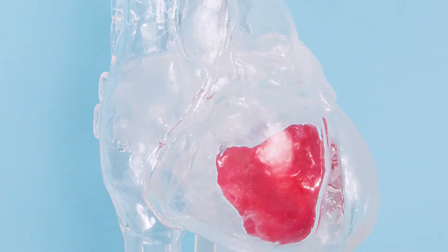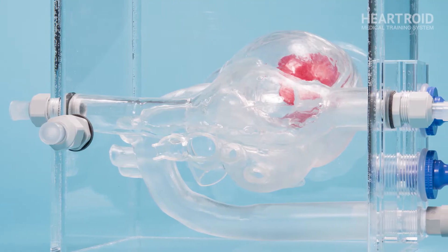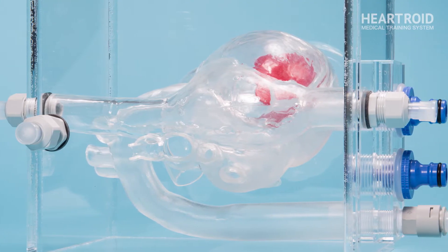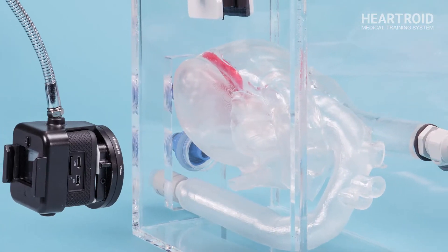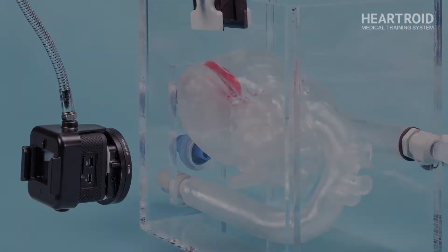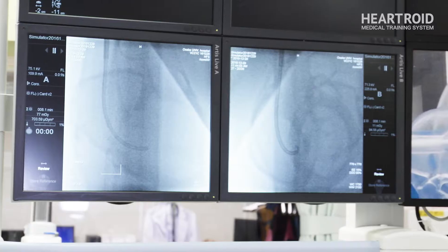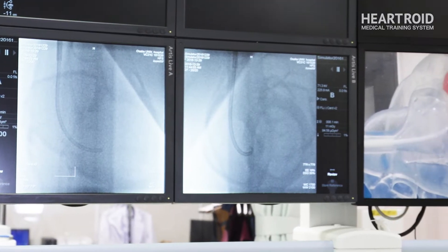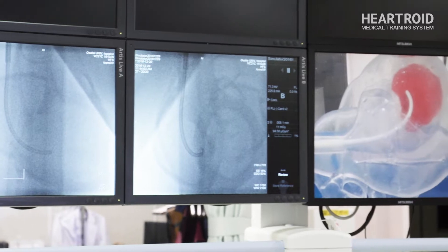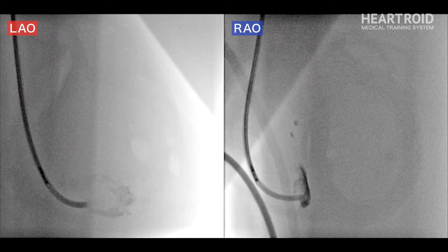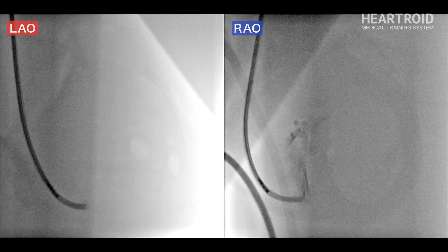This is an introduction to the myocardial biopsy procedure using the HeartRoid myocardial biopsy model. Let's begin the procedure using both x-ray and camera images. It is recommended to use the biplane mode using left anterior oblique and right anterior oblique views.